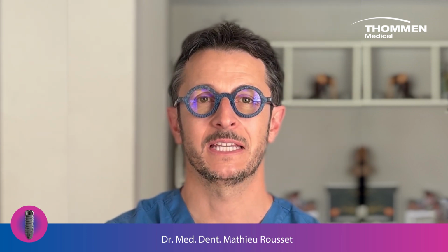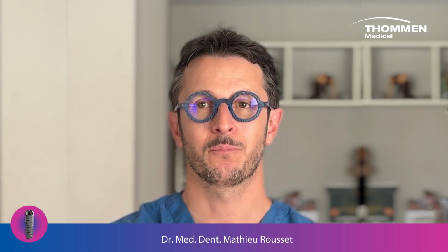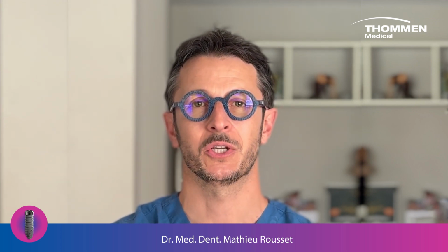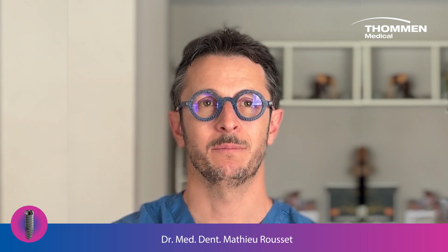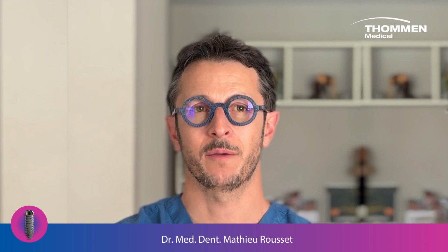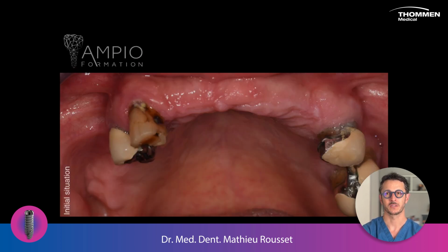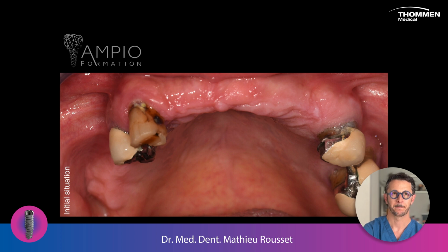I have a private practice with an implantology education center. In my daily practice, I use digital tools for each patient, like CBCT, intraoral scanner, guided surgery, photogrammetry, face scan, 3D printer. I will share with you two cases in which I use digital tools and the contribution of the Nevo implant in these protocols.